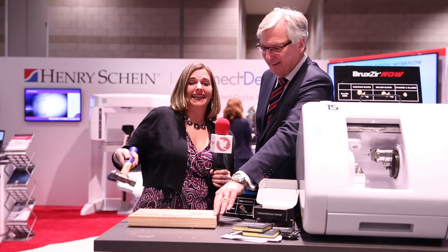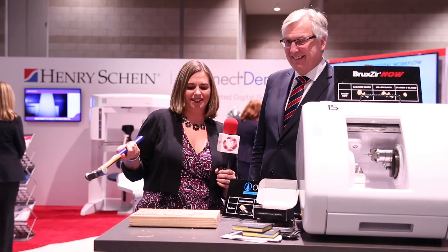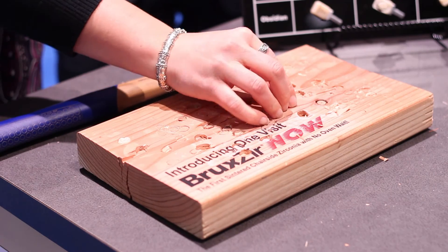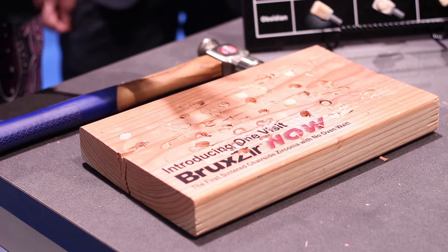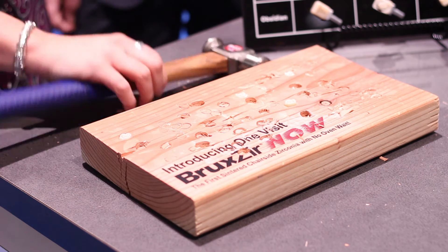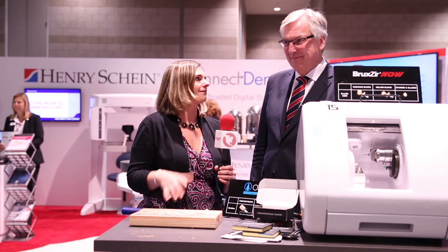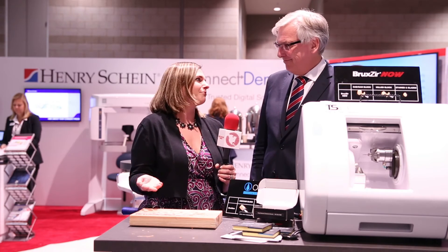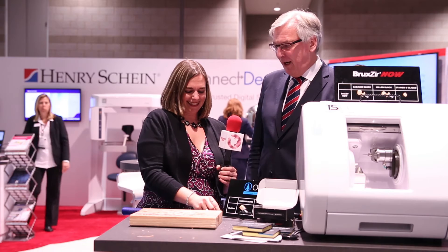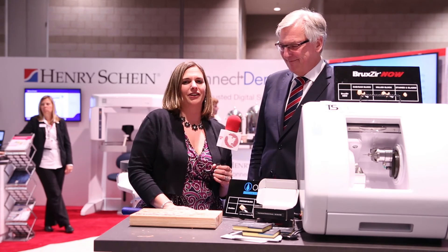It's actually breaking the board, and the zirconia crown is not even budging. It's still in one piece in here. Obviously very strong, proving the point. There's more damage here to this hammer than there is to the crown — so that's pretty incredible. It is strong. It's proven, and now it can be done chairside as well. Although we don't recommend this happening in your mouth.